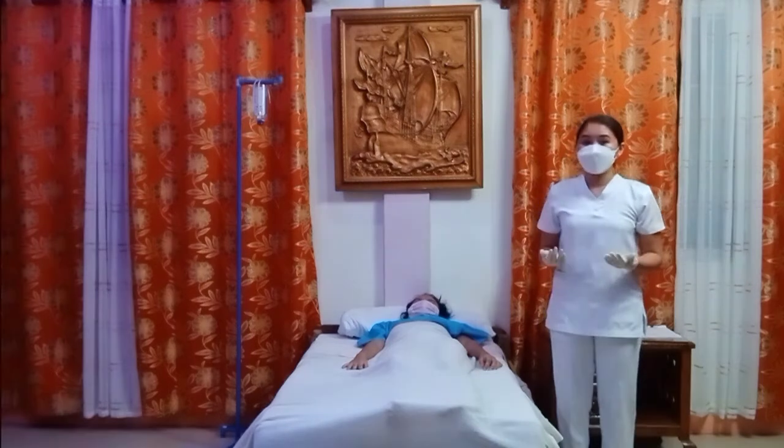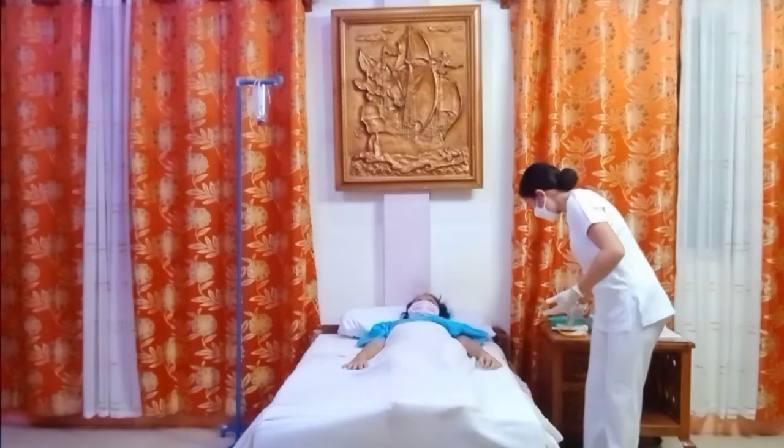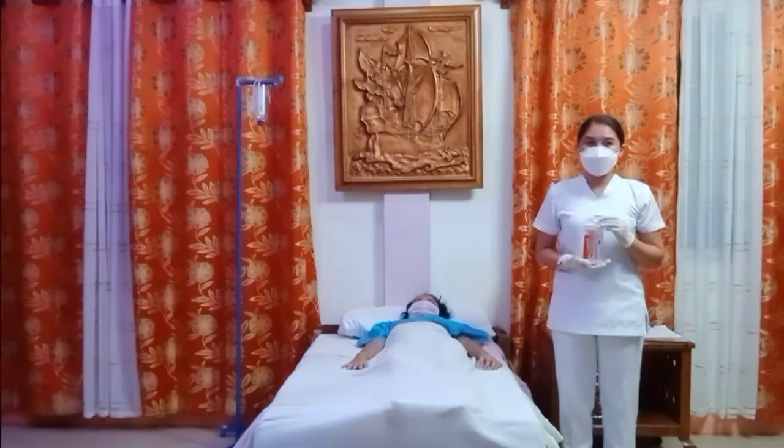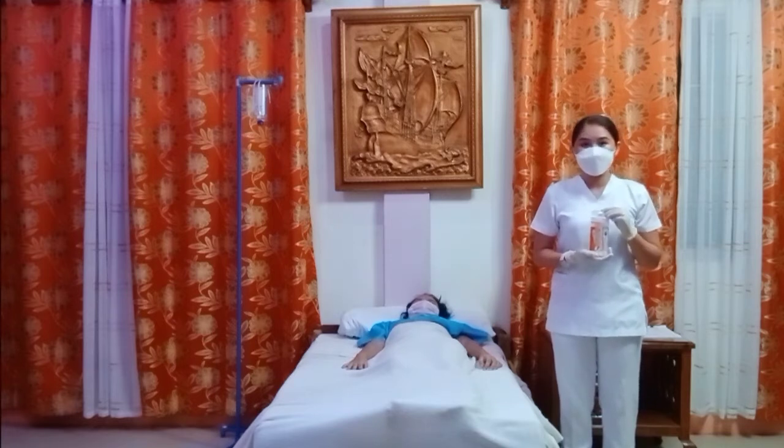Next is to place the thermometer. For oral temperature taking, disinfect from bulb's end towards the battery cup and place the bulb on either side of the frenulum and disinfect afterwards. Oral thermometers must be disinfected to prevent cross-contamination.